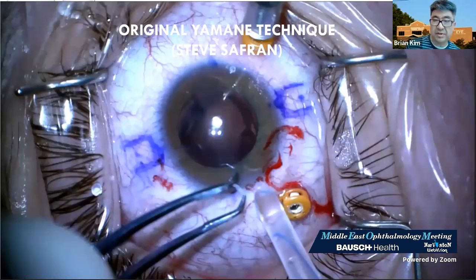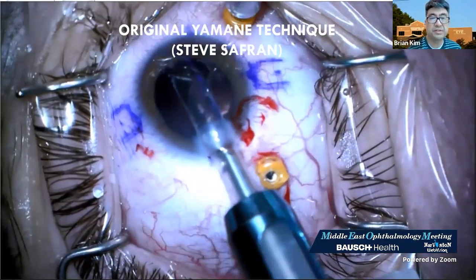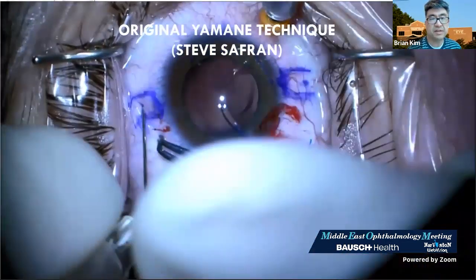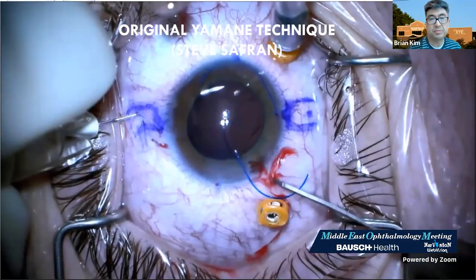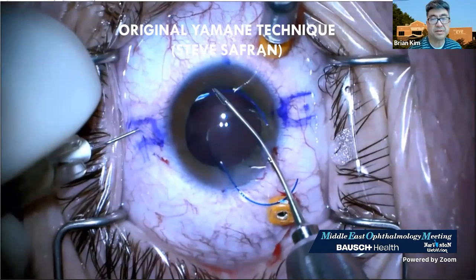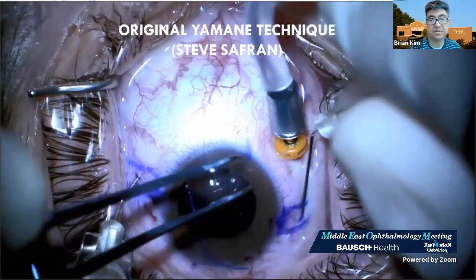My friend Steve Safran does it the classical way. And so let me just show, and he uses Dr. Aspen's marker for his technique. So let me go ahead and show this. So the lens is injected and he places the leading haptic into the angle. He starts on the left side and he tunnels and goes in. And he's going to use microforceps to place the haptic into the needle, releasing the left side, doing the similar technique on the other side.